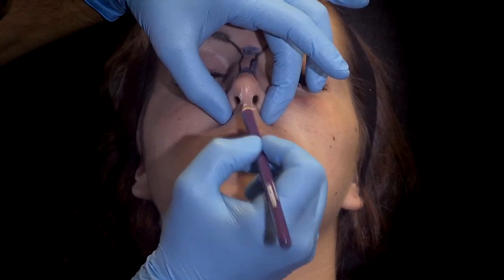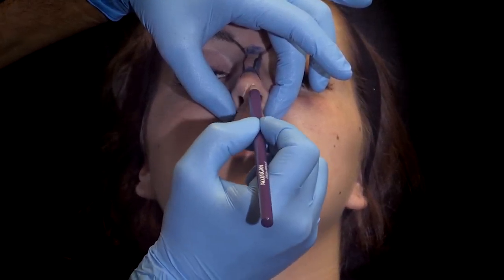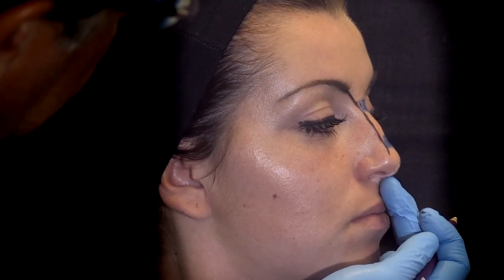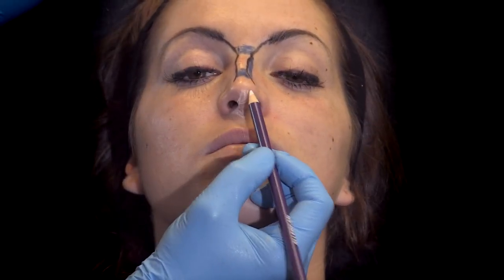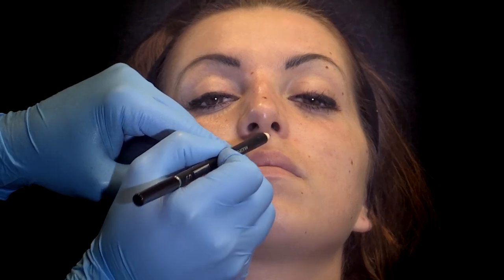But first, we may start with the Eiffel Tower concept by lifting the tip with a columellar strut with a thick volumizer HA gel to obtain a tip rotation. At the end, we will have a tip refinement with 2 light projections.